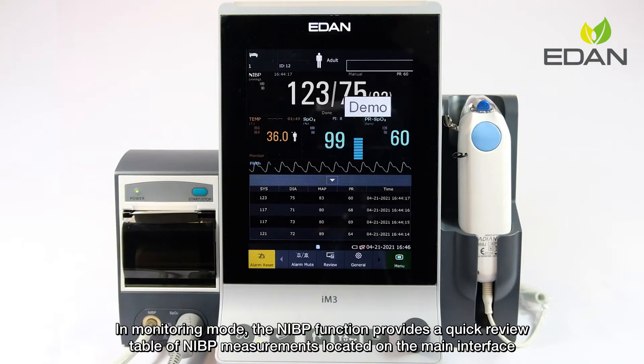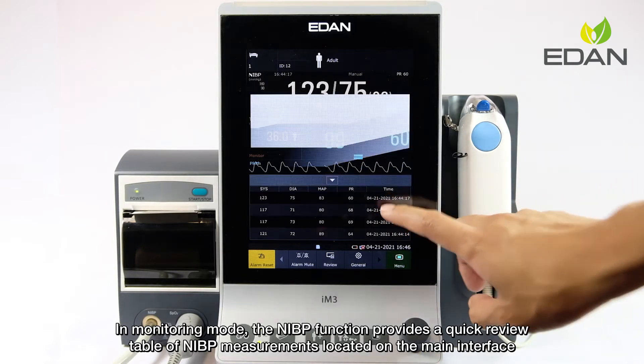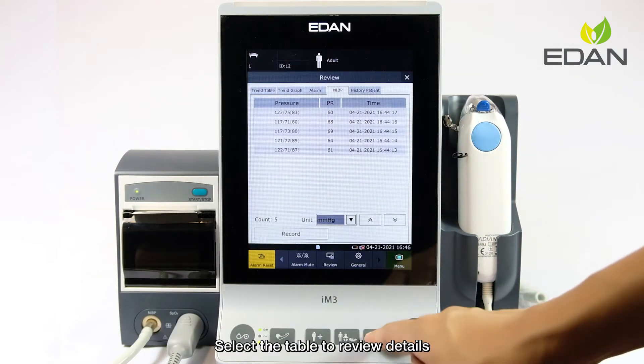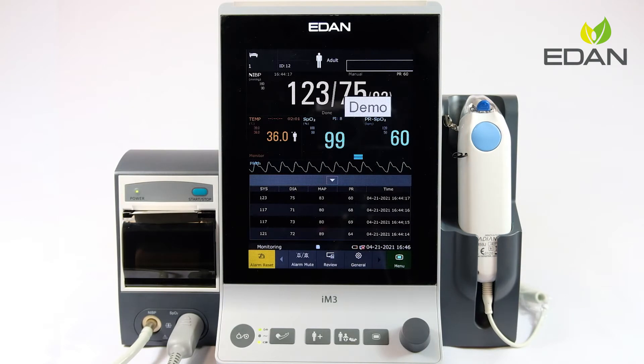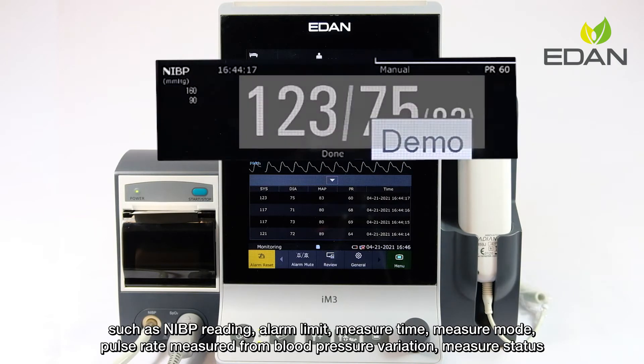In monitoring mode, the NIBP function provides a quick review table of NIBP measurements located on the main interface. Select the table to review details. The NIBP numeric field also provides multiple information displays such as NIBP reading.